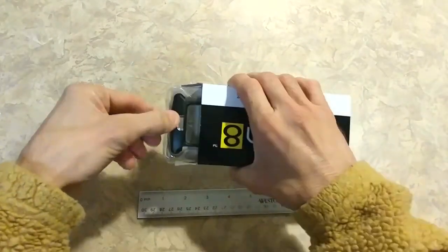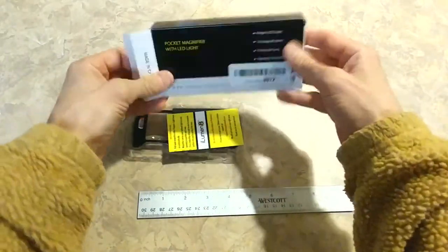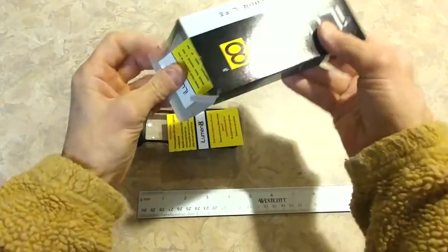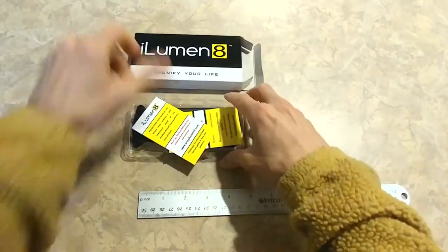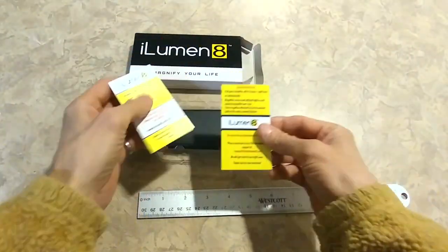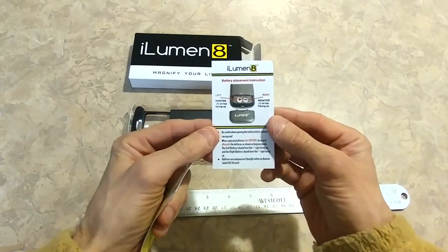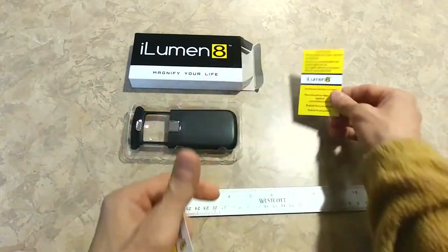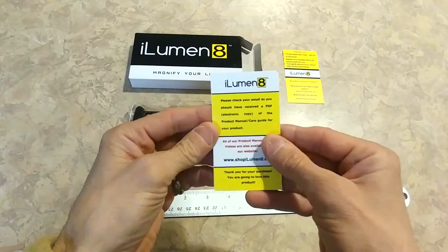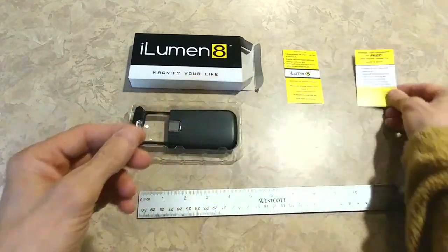Opening it up, it comes with an instruction manual — how to put the batteries in, how to use it. Pretty simple. And a warranty card. You can double your warranty. Nice.